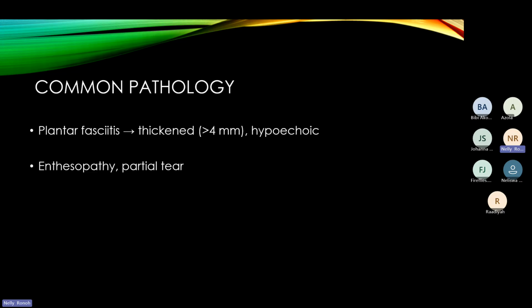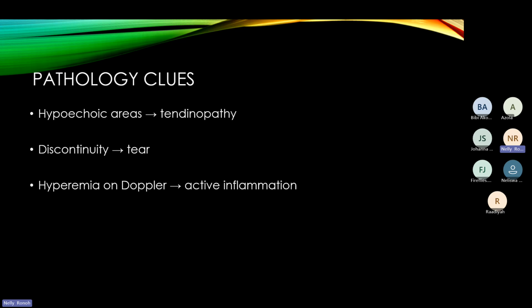Then we could also have partial tears or any other kind of inflammation. We even have what is known as Ledderhose syndrome for the plantar fascia, where you find there are hypoechoic masses within the plantar fascia itself. But that one is not usually an acute thing. It is chronic actually.